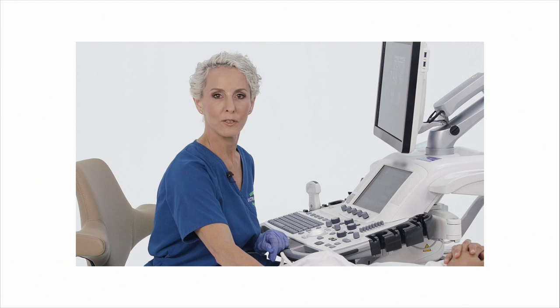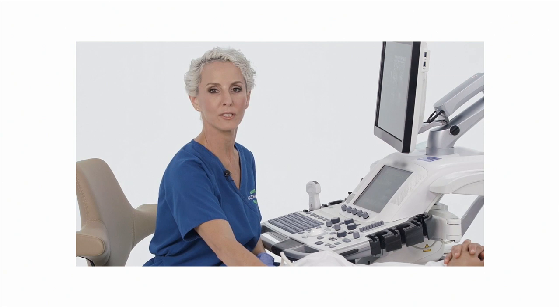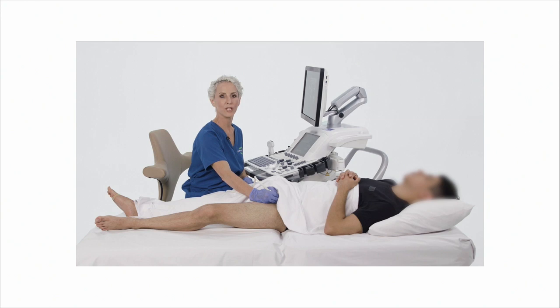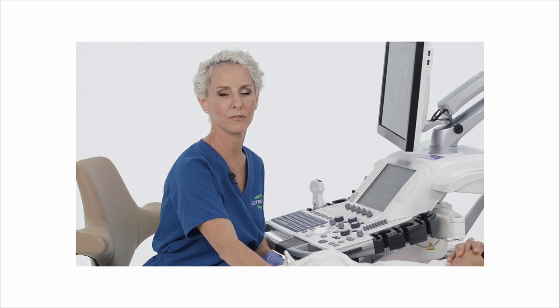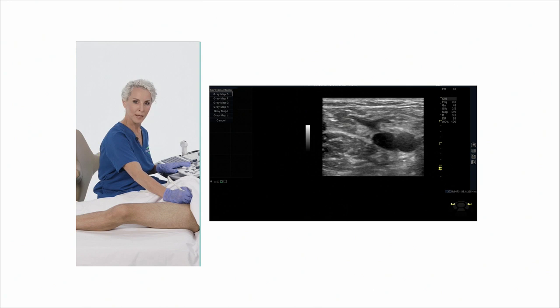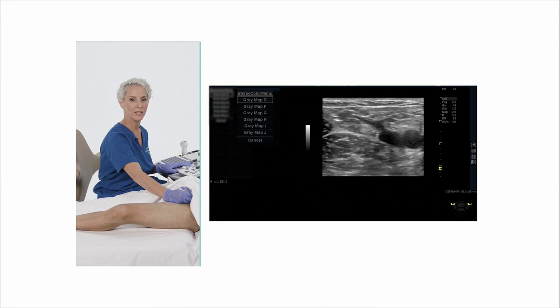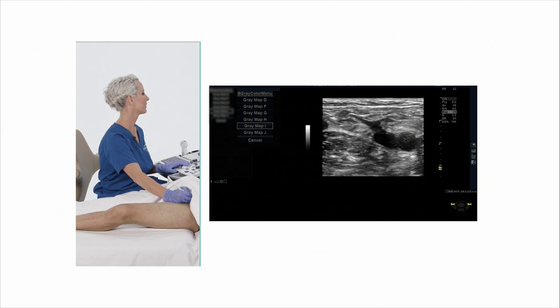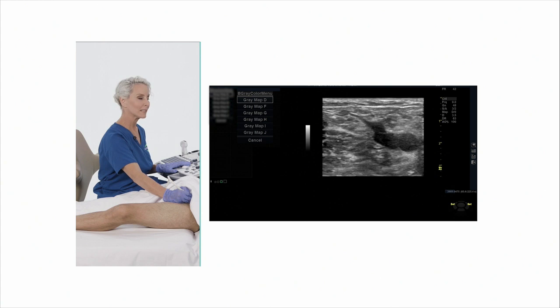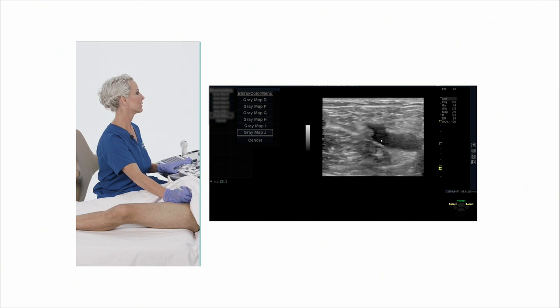Lowering the dynamic range gives more contrast to the image — helpful when trying to identify the adventitia of the artery or vein. Grayscale maps are used in conjunction with dynamic range. While dynamic range increases or decreases the quantity of shades of gray, B-mode maps change how bright stronger echoes are displayed and how dark softer echoes are displayed. Your ultrasound system has various grayscale maps to choose from, and adjusting them assists in differentiating between separate anatomic structures.